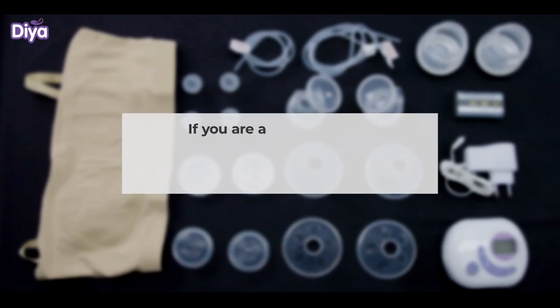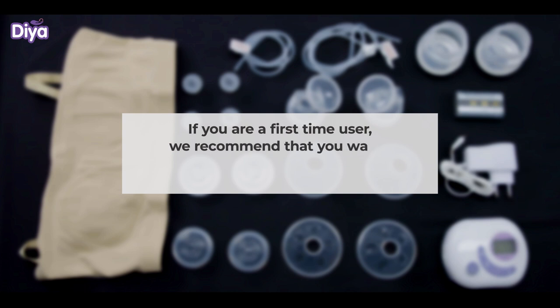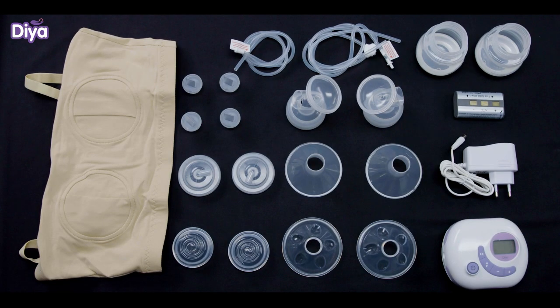Assembling the Pump. If you are a first-time user, we recommend that you watch the steps of assembling the pump till the end.